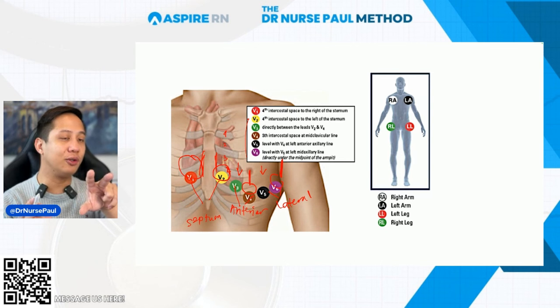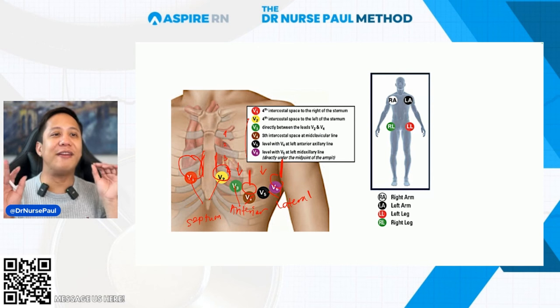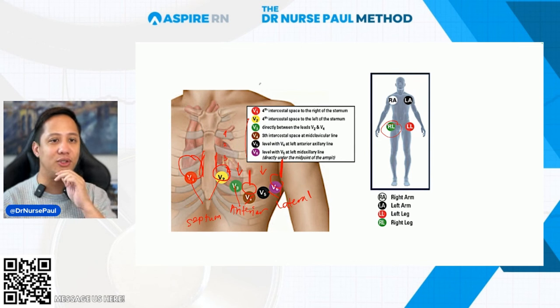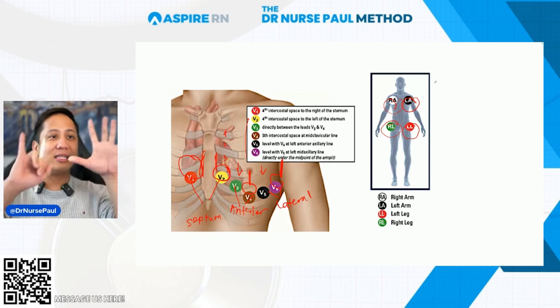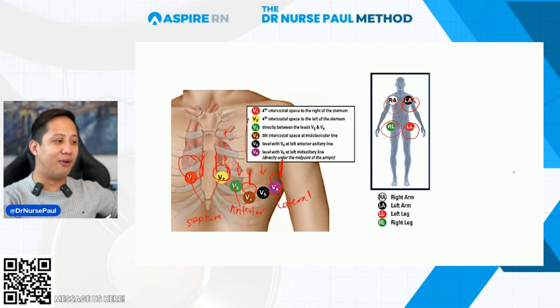you from getting electrocuted. In the EKG, we can capture extra waves. We call them artifacts, all right? That's the purpose of the green, the RL. The RL is only a ground, right? It does not do anything other than make sure that we're not getting any extra electrical impulses. Are we clear? So only the 3 count. By using RA, LA, and LL, you can actually check 6 more leads. So remember, V1 to V6 look for septum, anterior, lateral, right?